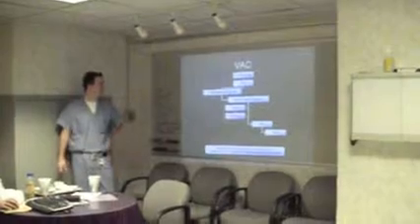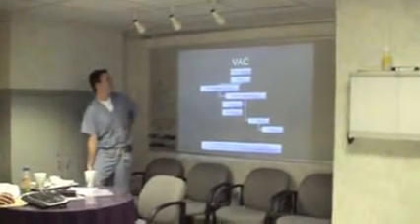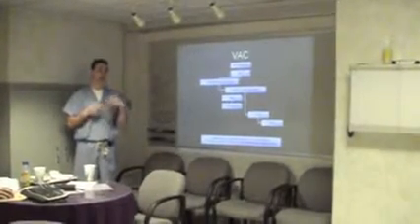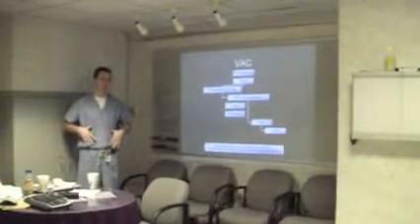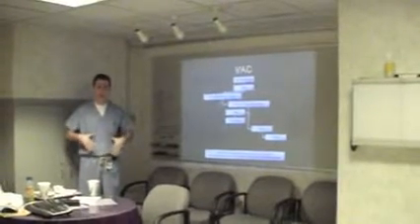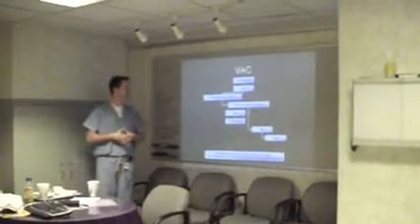This may look familiar to you guys, as we talked about yesterday in my other lecture. If you've got a patient with an open abdomen, you can place a wound vac and check it every 2 to 5 days. If you're unable to close the fascia, the wound vac allows constant pressure, constant medial traction bilaterally to allow you to close the fascia.